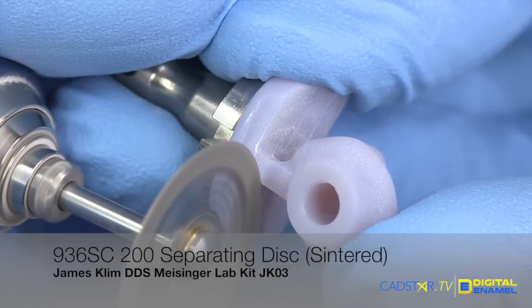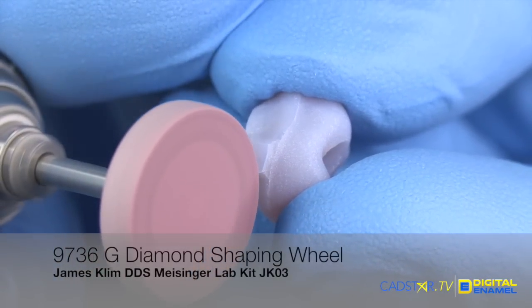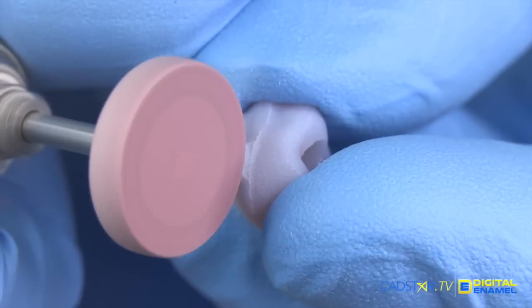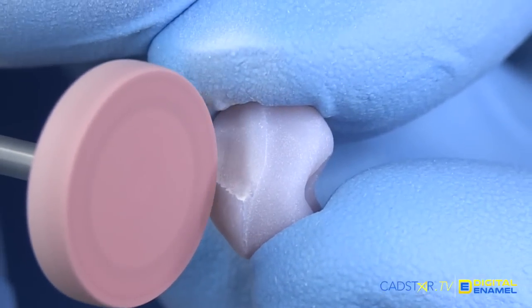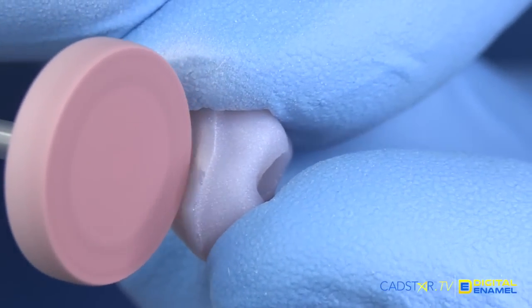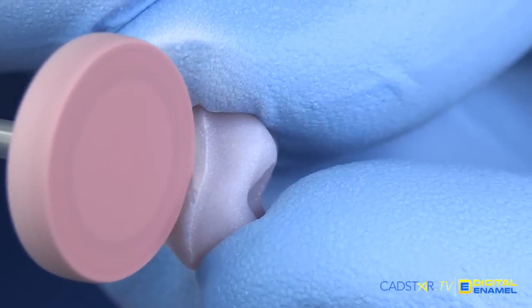We're going to separate the abutment using our separating disc. I do like this diamond — this is a wheel shaping diamond on the JK03 Lab kit. What's nice about this diamond is you can rapidly shape and remove ceramic without overheating the ceramic, preserving the integrity of your ceramic surface. We're going to carefully remove that sprue. Make sure we don't touch that margin.